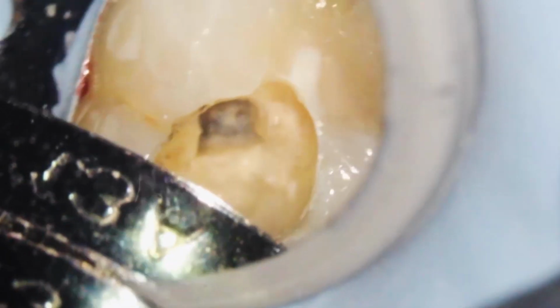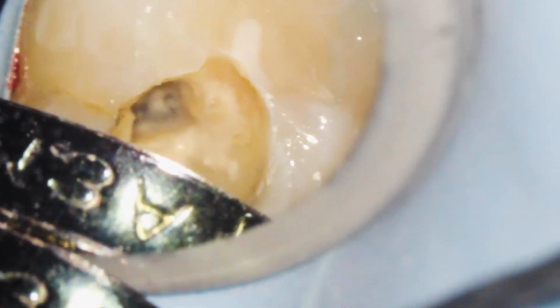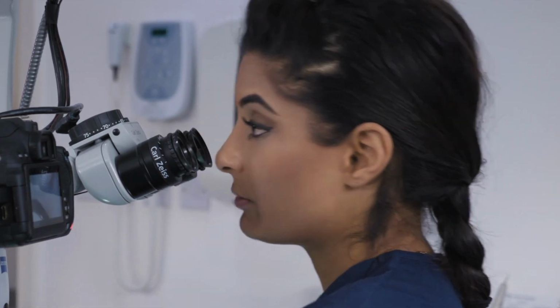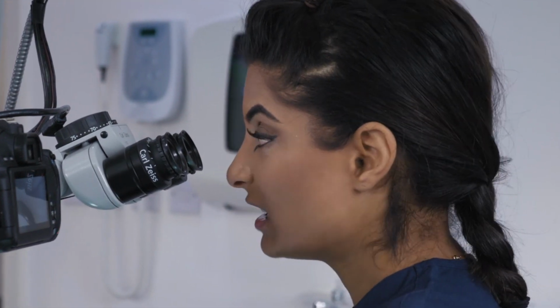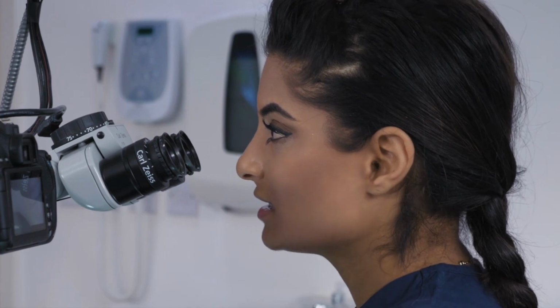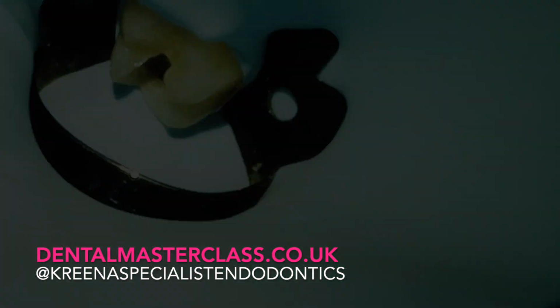Very much in terms of access, with traditional accesses we looked for a lot of landmarks, but for more conservative access cavities, which is a lot better for teeth because we preserve more tooth structure, I tend to modify the access just according to what I need. So I'll enlarge slightly, I'll check if I've got reasonable straight line access to the canal, and then I'll enlarge a little bit more. So access is more of a process, it's more of a refinement throughout the procedure.